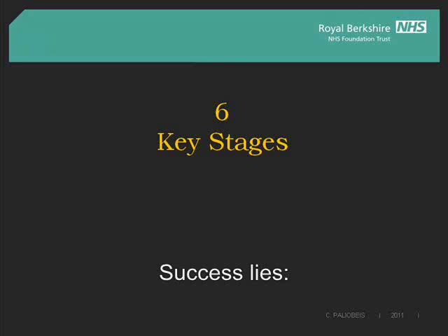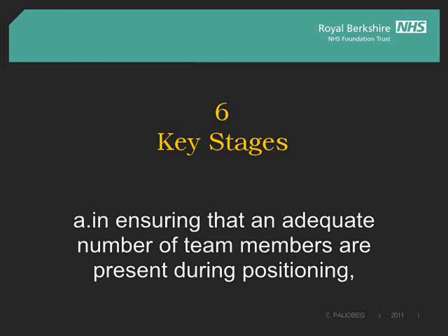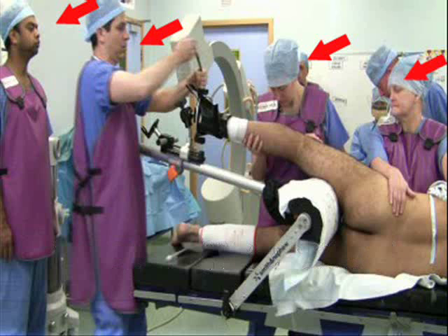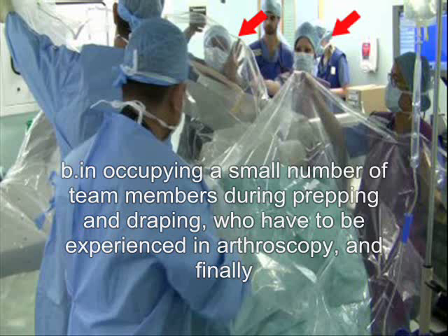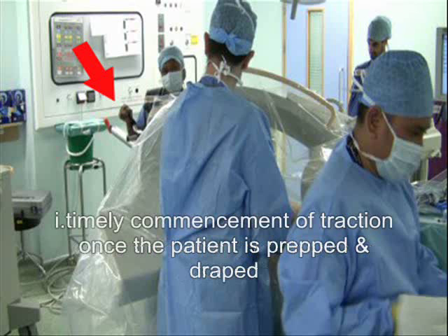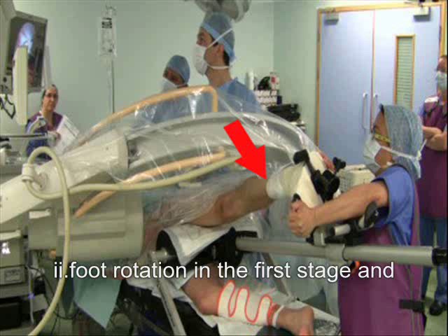Success lies: A, in ensuring that an adequate number of team members are present during positioning, who pay attention to the sequence of events and of instruments; B, in occupying a small number of team members during prepping and draping, who have to be experienced in arthroscopy; and C, in spending a few minutes to allow for timely commencement of traction once the patient is prepped and draped, foot rotation in the first stage, and release of traction and hip flexion and extension in the second stage.